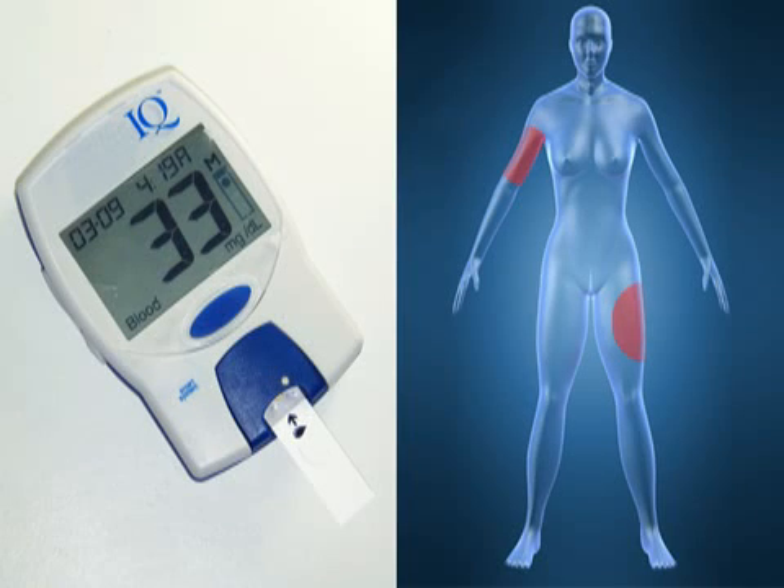If you are uncomfortable with frequent finger pricks, you may want to try one of the new methods for blood glucose testing approved by the Federal Drug Administration. One of these is a glucose meter that tests alternative and sometimes less painful sites like the upper arm or thigh.